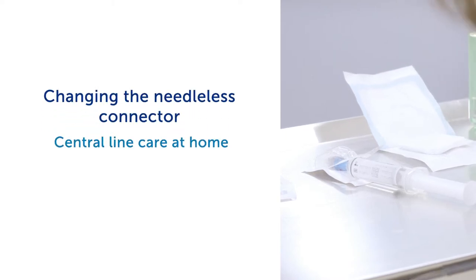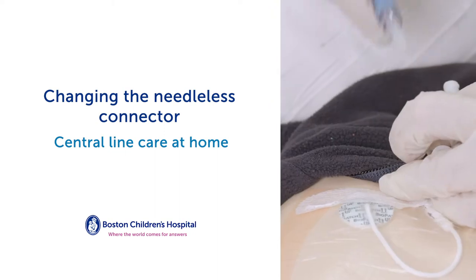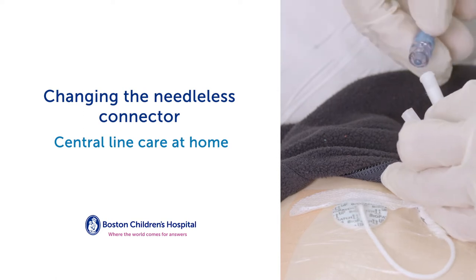Changing the Needleless Connector. This video teaches you how to change the Needleless Connector. You should change the Needleless Connector as recommended by your health care team. Follow these steps.